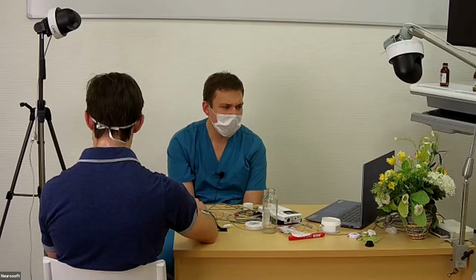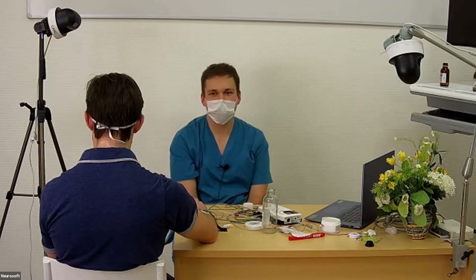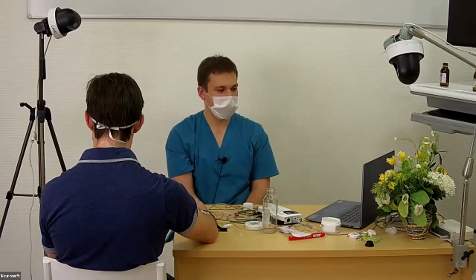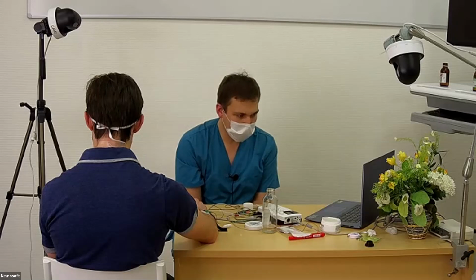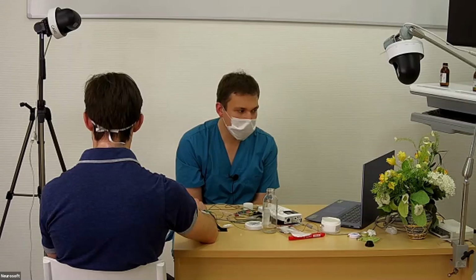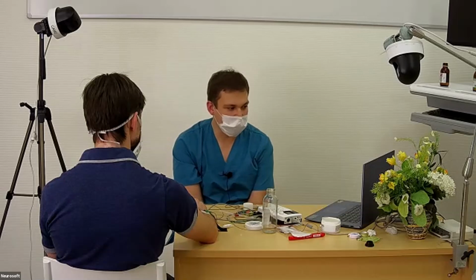In this technique, it is necessary to do it with muscle contraction, because the goal is to see a gap during the interference pattern, the interference contraction electrical signal from the muscle. In this situation, we stimulate sensory fibers and record a signal from the muscle. Yes, really, it's a spinal reflex, a spinal inhibitory reflex.